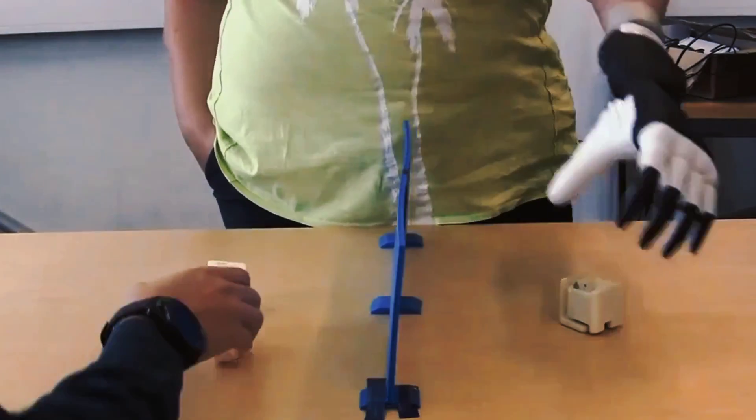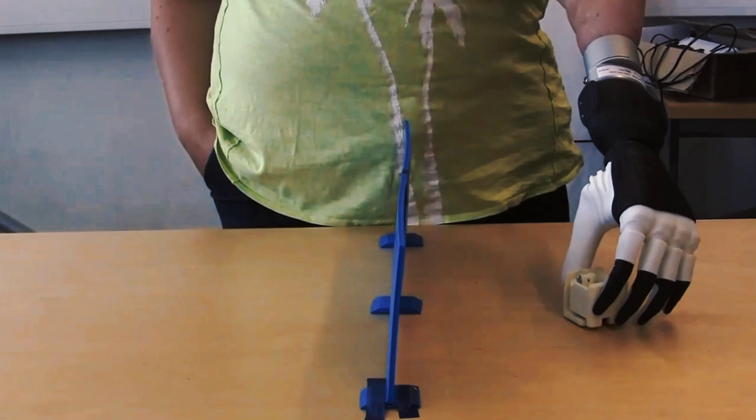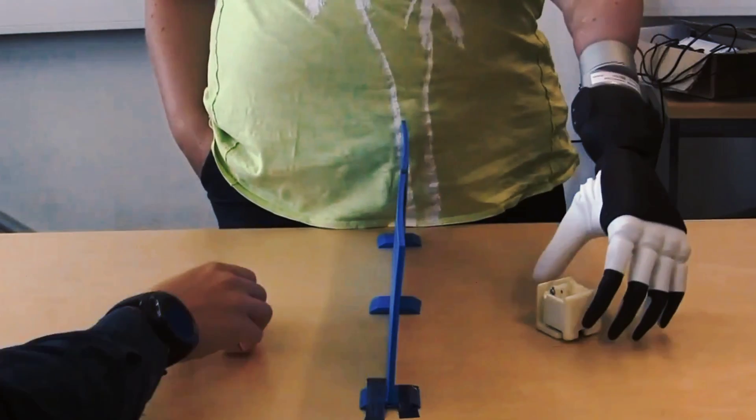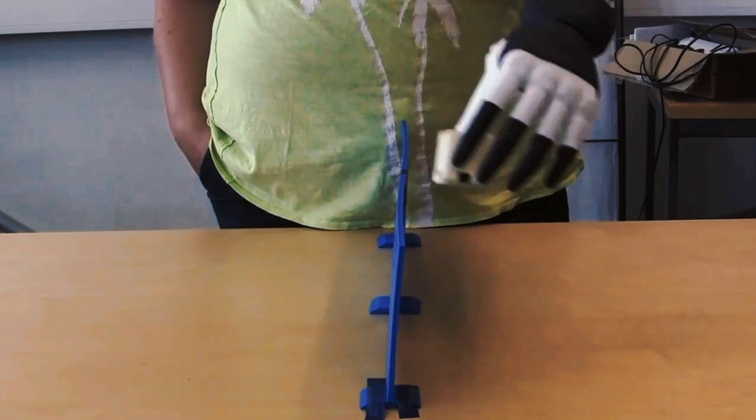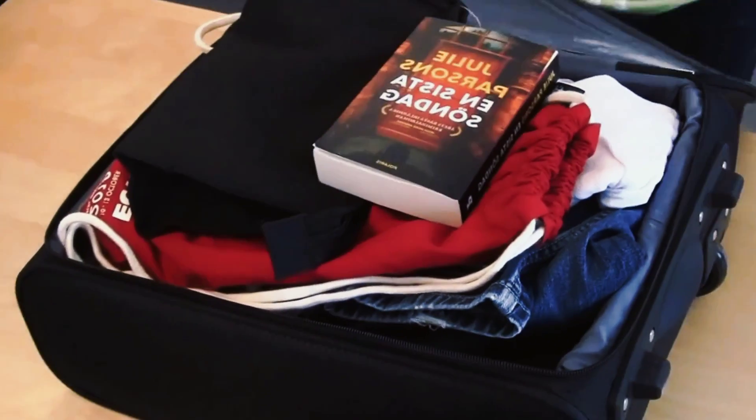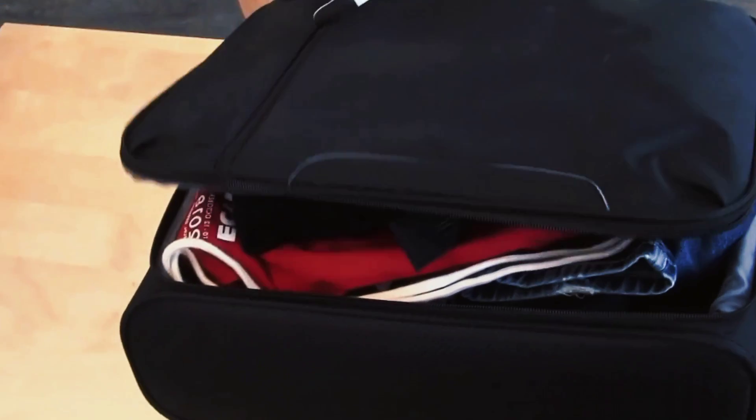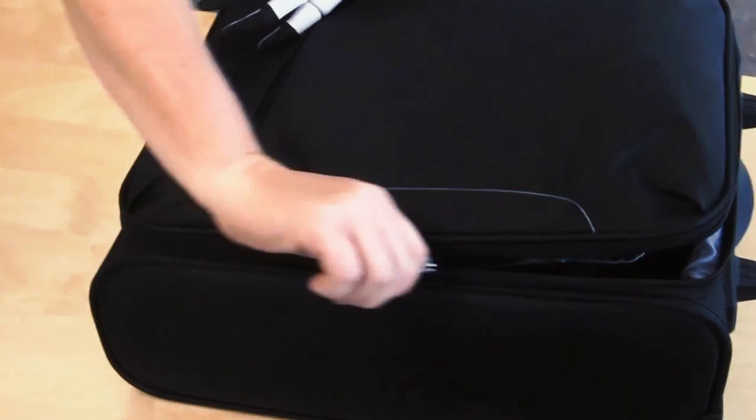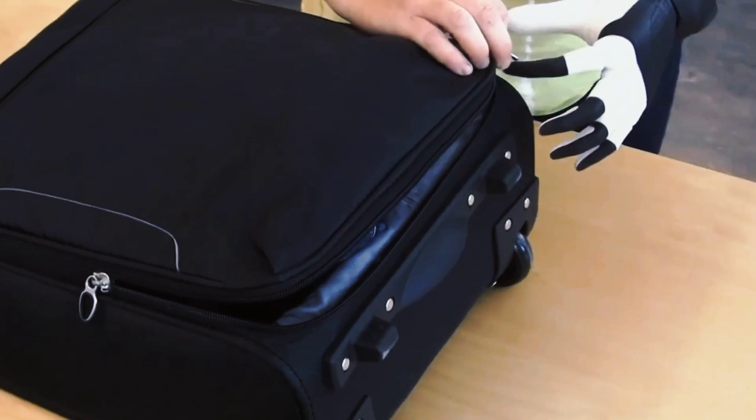Karen underwent these procedures in 2019 and received a new bionic hand called Mia Hand, developed by Prinsilia, an Italian company that manufactures robotic limbs. The Mia Hand has 16 sensors that can detect pressure, temperature, and vibration, and transmit them back to Karen's brain through the electrodes.